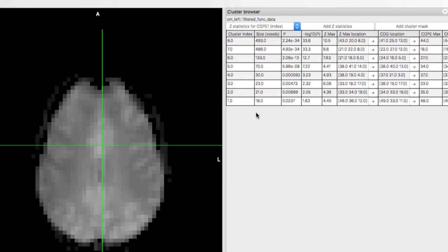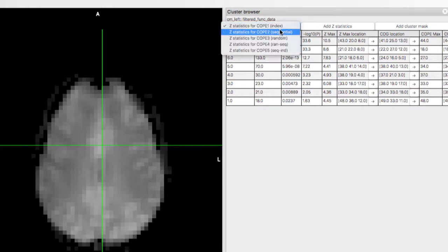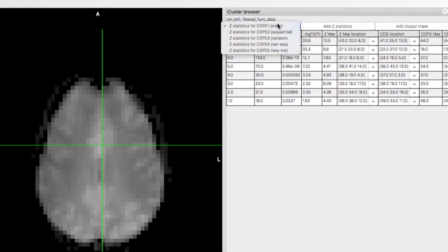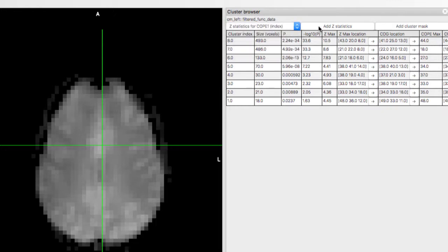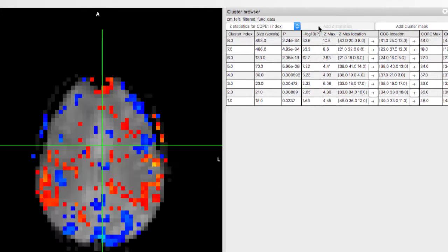In this experiment, we have five contrasts, one for each of the simple effects, and two that take the difference of the beta weights for different regressors. If you click on Add Z Statistics, this will overlay the Z statistics map for that contrast, which is the same thing as adding a new overlay from the file menu.